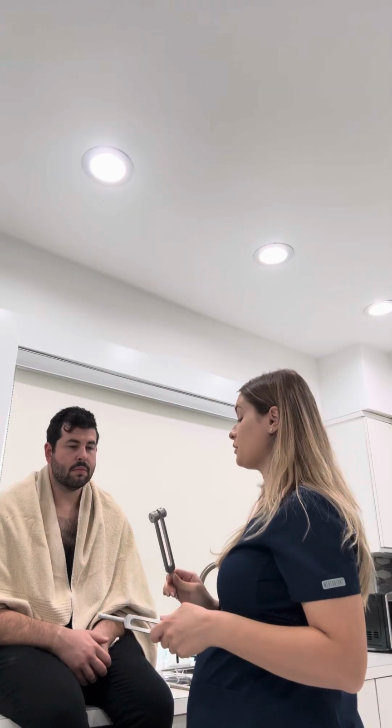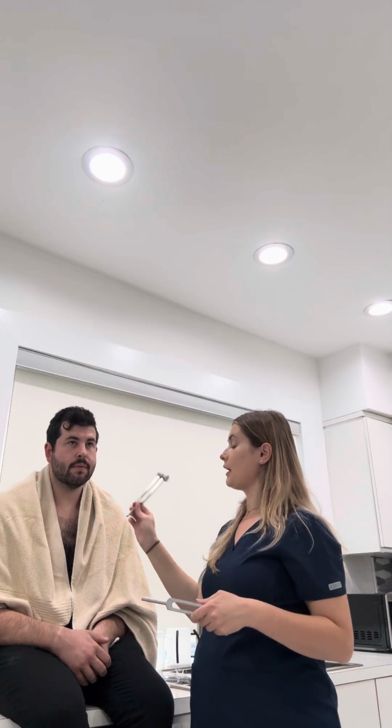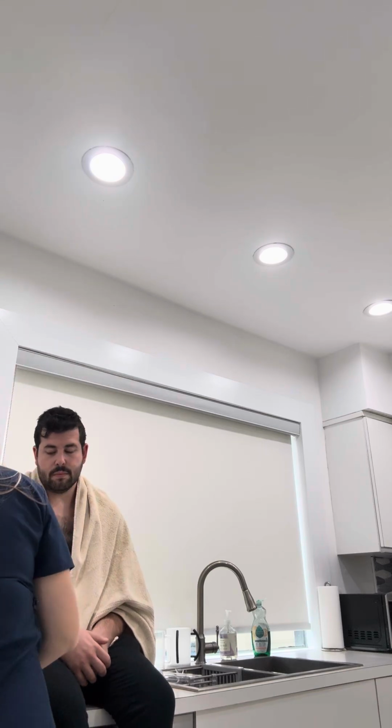The normal findings. Now I'm going to be striking the tuning fork again, placing it behind your mastoid process. Tell me when you stop hearing. No. Do you hear? Yes. Okay. Good. Same thing on the other side, behind your mastoid process. Yes. Okay, good. Air conduction is greater than bone conduction. These are normal findings.